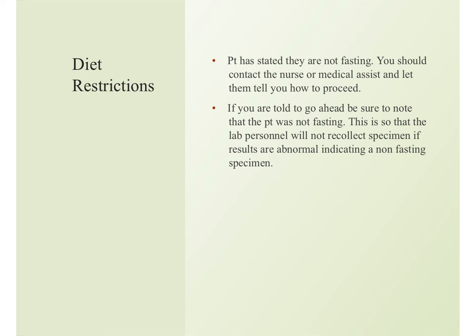So officially, if the patient has stated that they are not fasting, you should contact the nurse or medical assistant, the office staff that ordered the test, and let them tell you how to proceed. If you are told to go ahead, be sure to note that the patient was not fasting. This is so the lab personnel will not recollect the specimen if results are abnormal, indicating a non-fasting specimen. Also, the results just get pushed through too. That happens more than them getting redrawn. There are specific tests that get redrawn all the time because you just can't brush past it.